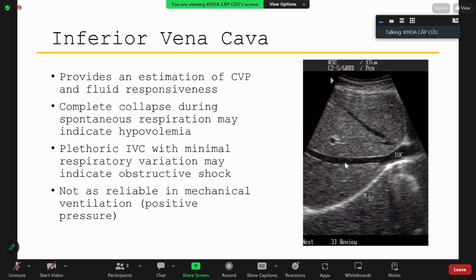So if you have that subxiphoid view and you tilt the probe up and you take a look at that heart, that vessel should be leading right into the heart, which you wouldn't see based on the anatomy for the aorta, which, as we all know, comes into the heart more superior as opposed to the inferior IVC going into the right atrium.